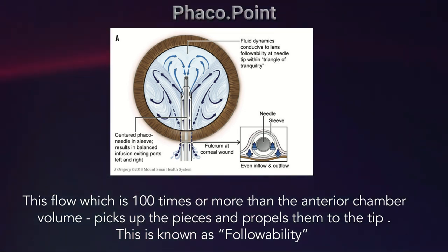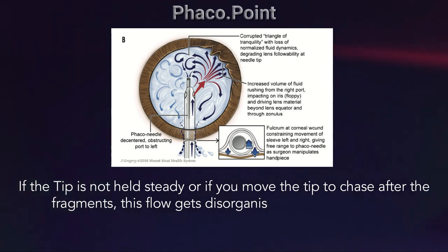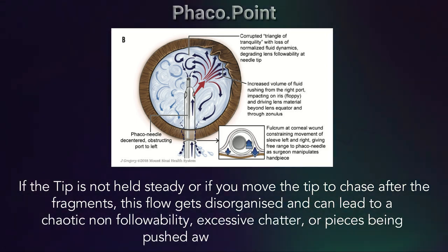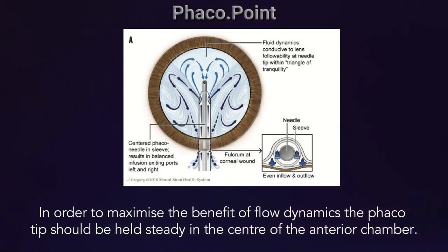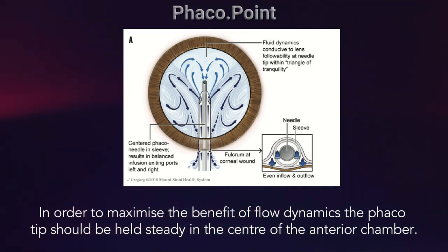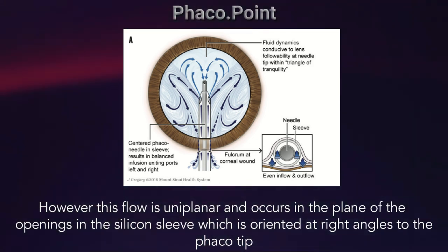This is known as followability. If the tip is not held steady, or if you move the tip to chase after the fragments, this flow gets disorganized and can lead to chaotic non-followability, excessive chatter, or pieces being pushed away from the phaco tip. In order to maximize the benefit of flow dynamics, the phaco tip should be held steady in the center of the anterior chamber. However, this flow is uniplanar and occurs only in the plane of the opening of the silicone sleeve, which is oriented at right angles to the phaco tip.